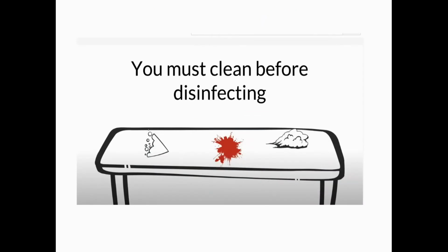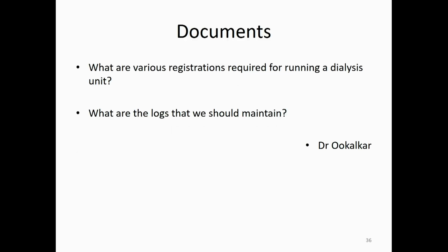and then otherwise clogging, bicarbonate suction, calcium may not be good. So that's it. We had earlier with Nipro machines, we had acidosis at the end of dialysis and hypotension, every problem. So hot citrosteril is a must at the end of the day.